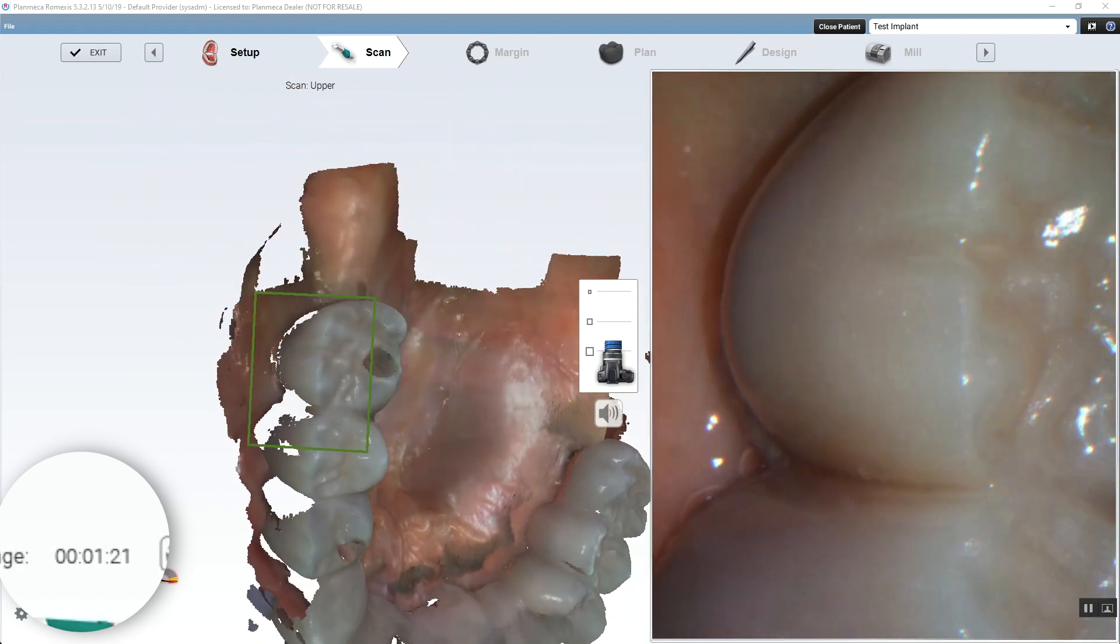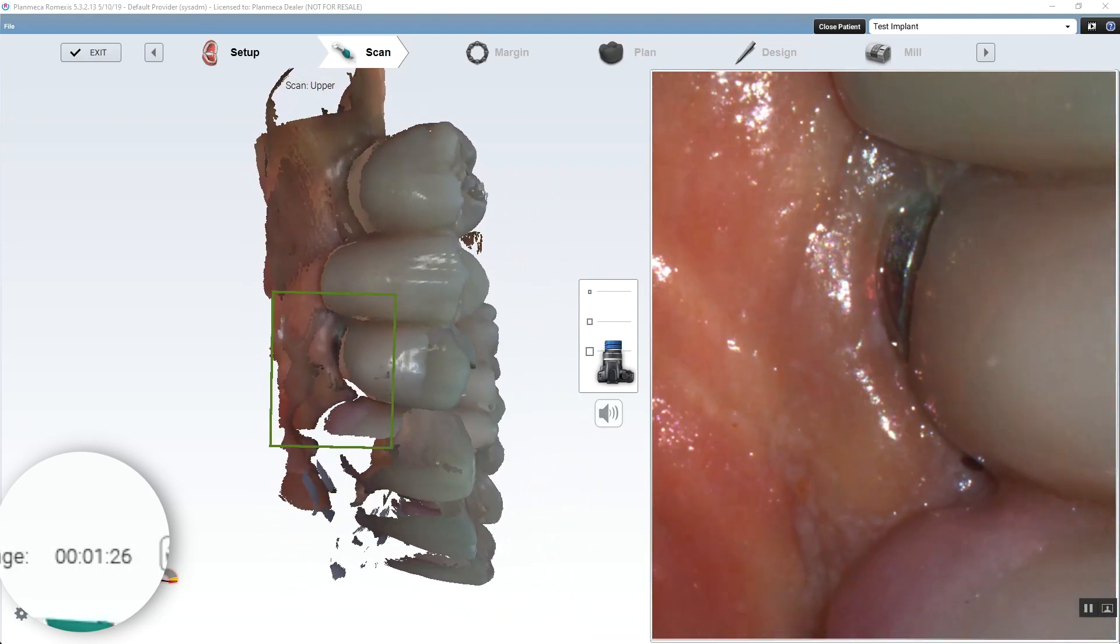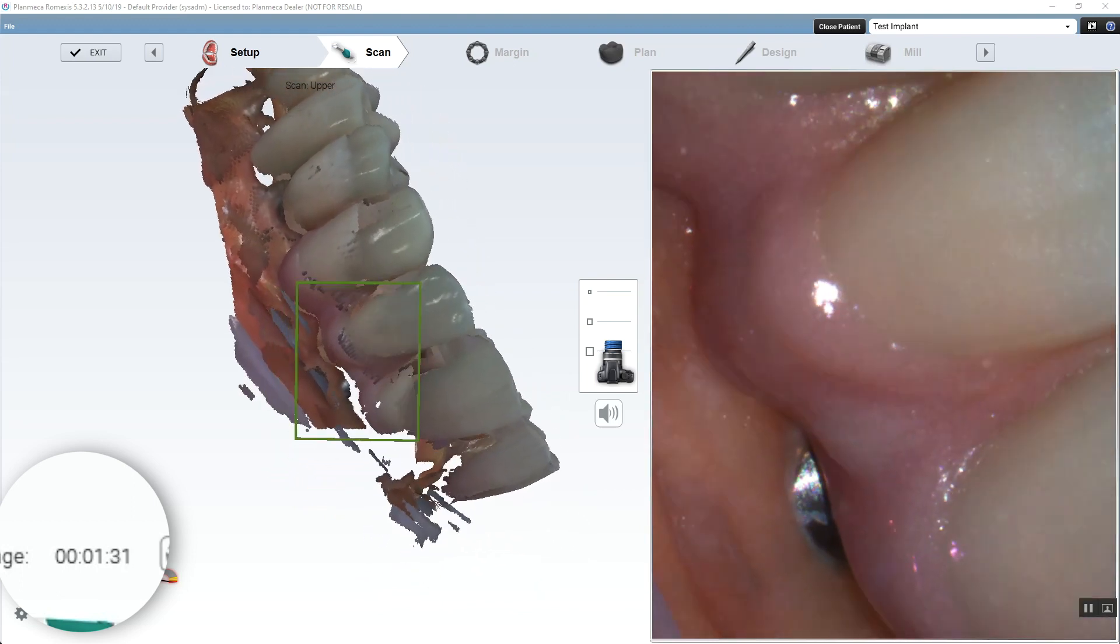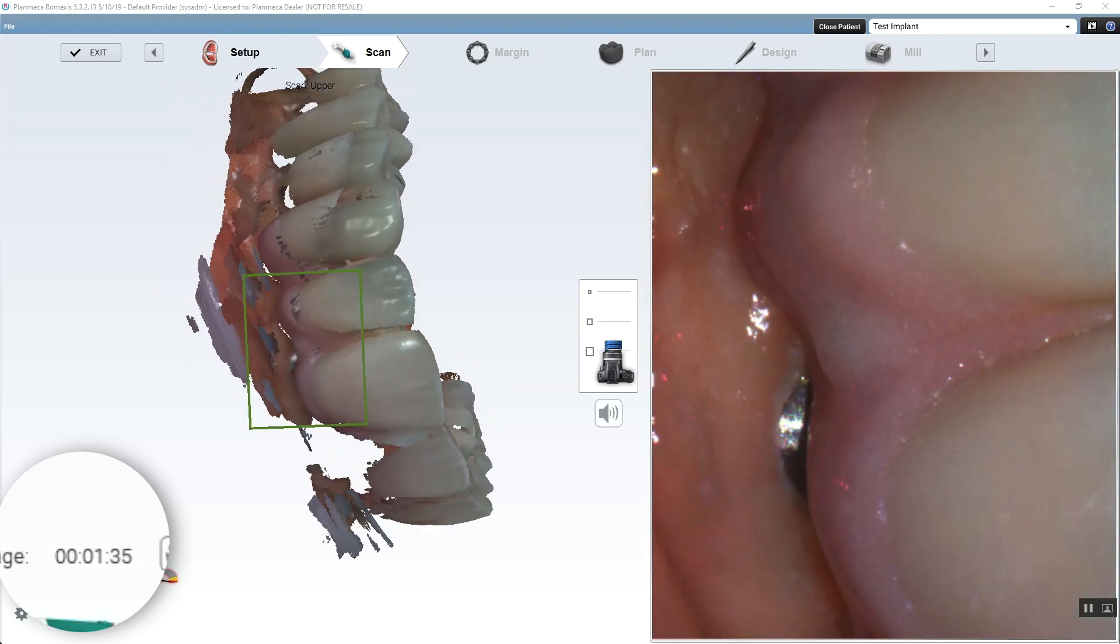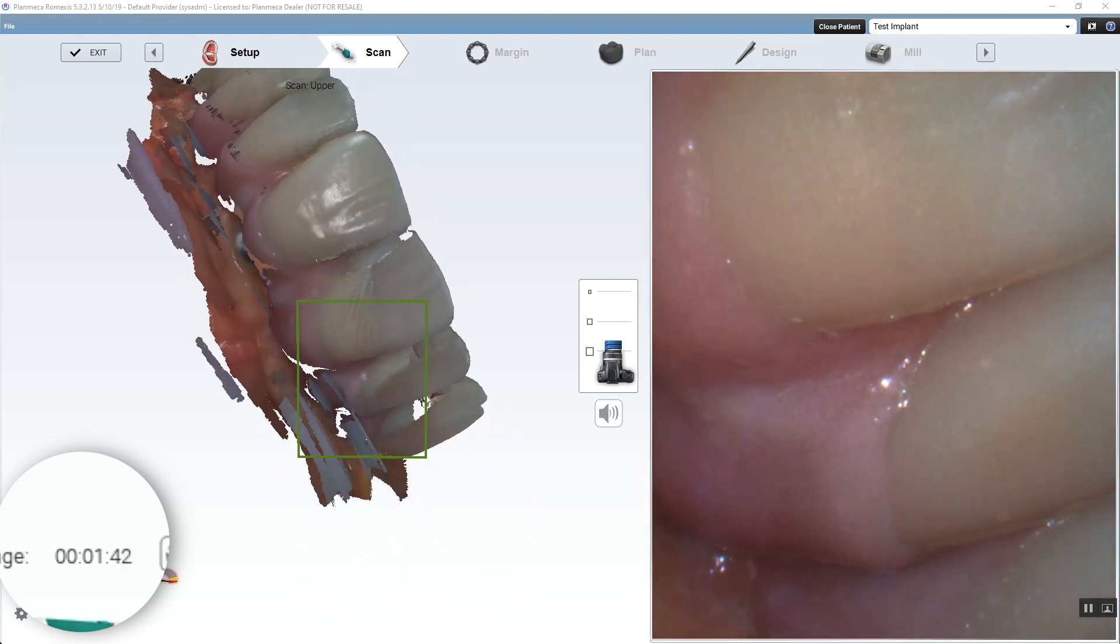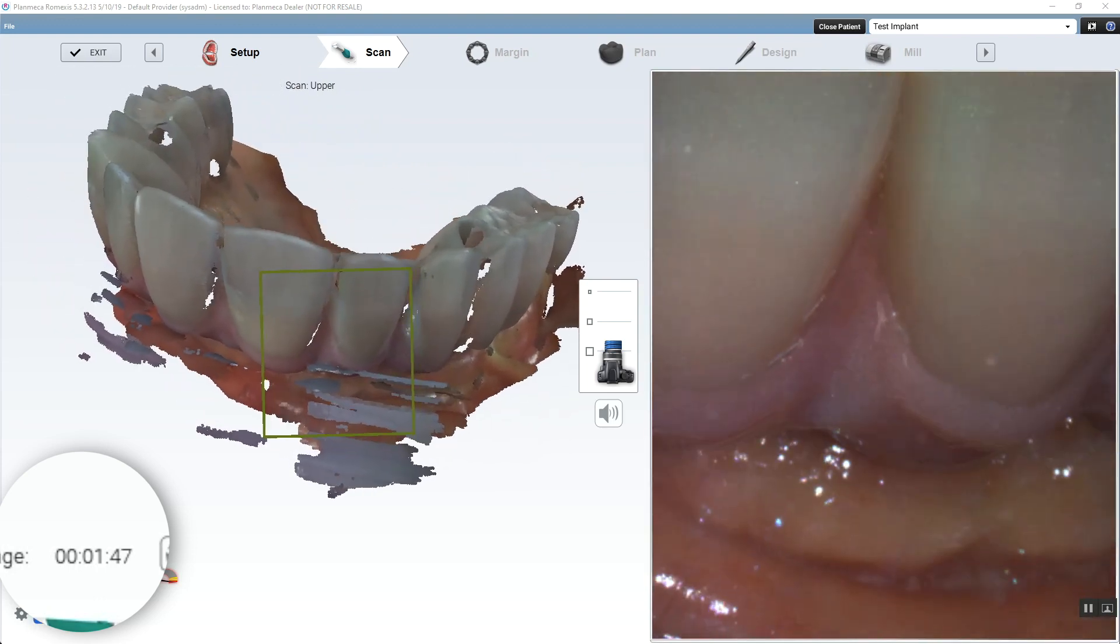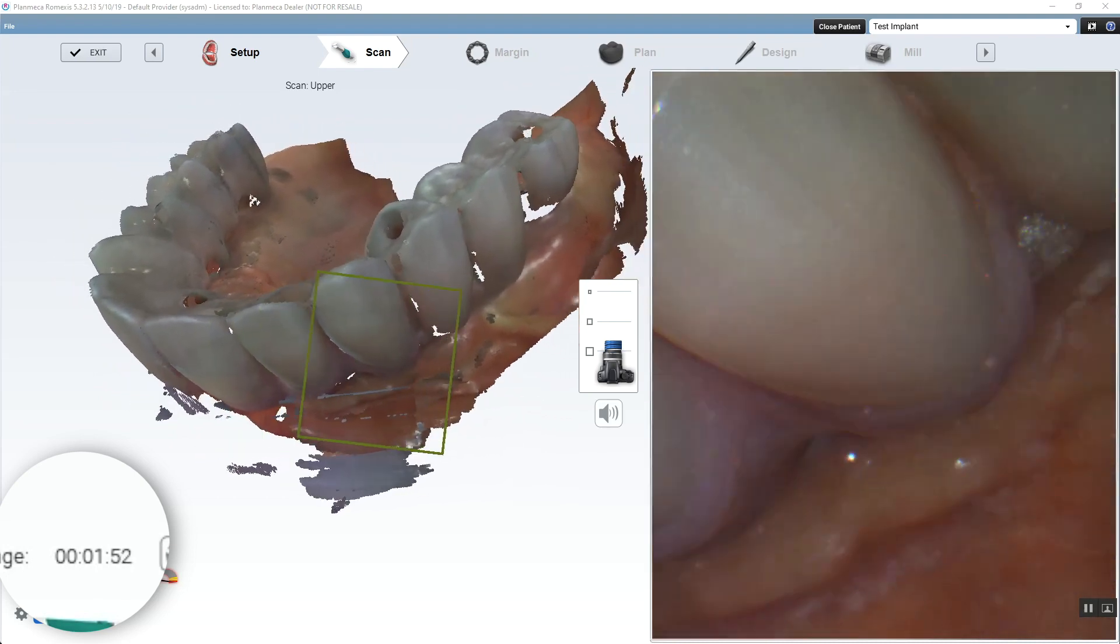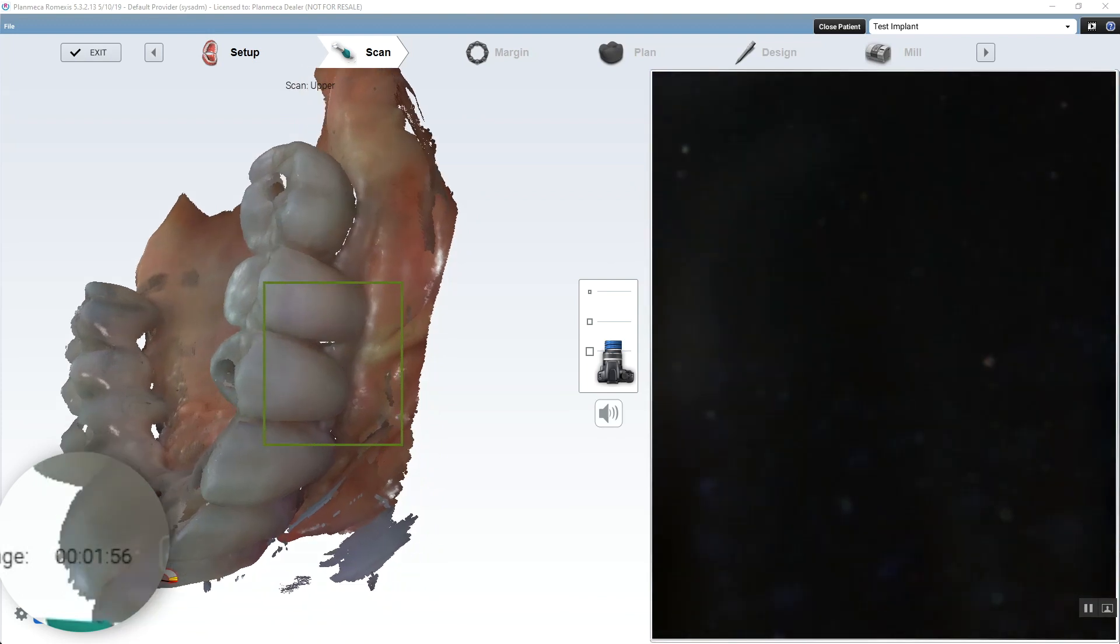This is not a really easy case to scan with most scanners. So I'm trying to get down underneath this restoration, trying to get some connection there. I'm going to maybe use a little active delete right there to try to melt some of that obturate away. There we go. Okay, I think we're pretty good for what we need.